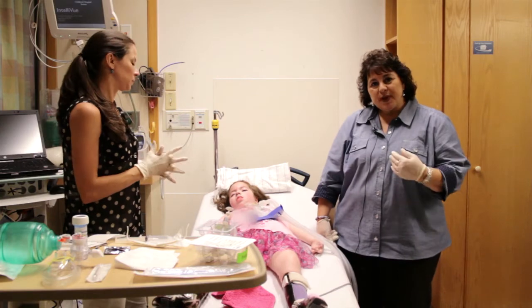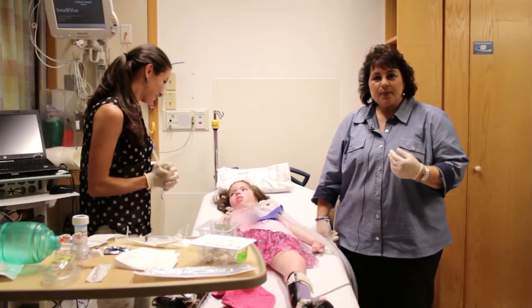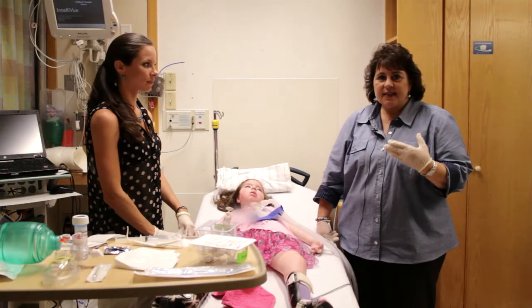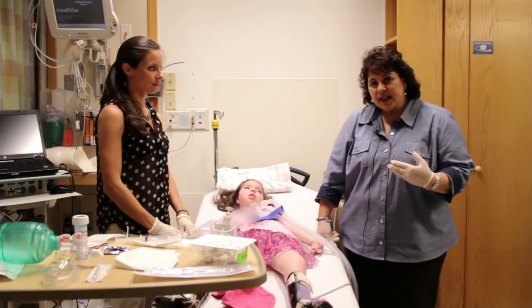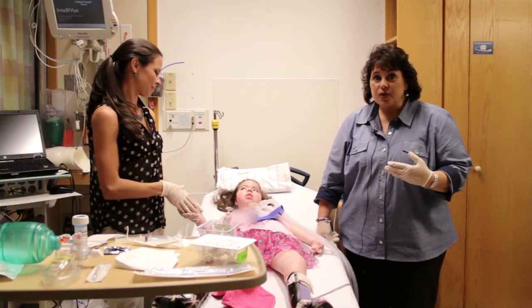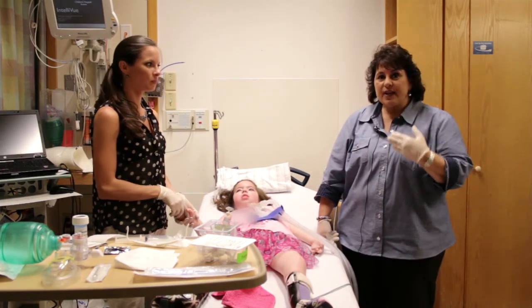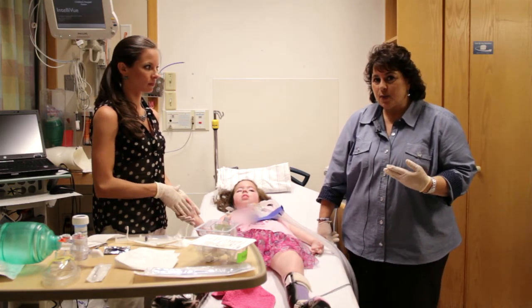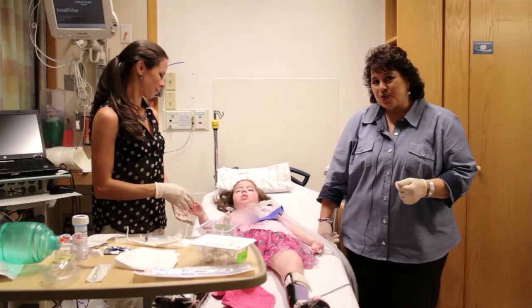And remember that when the tube comes out of Drew, that's mom's opportunity to take a look at that stoma site and think about it like a clock, 12 o'clock, 6 o'clock, 3 and 9, and see if there's anything. Pink tissue, white tissue, is it perfectly round, is it egg shaped, whatever she happens to see in that very quick moment. Drew is on a ventilator, so timing is of the essence, and she can't, as we talked about with other children that maybe aren't on a ventilator or can breathe out their nose and mouth in addition to it. We don't have that time to really just look at that stoma site. We're going to look quickly and insert the new tube.